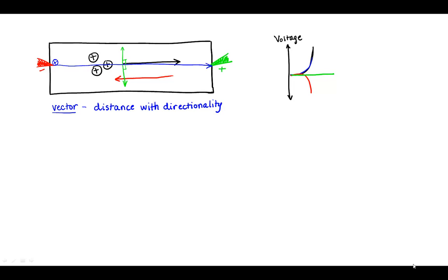Now, applying this concept of using pairs of electrodes to detect moving charges to a patient in order to get an EKG tracing, you might expect that you could put two electrodes on the patient's body and use them to detect how the heart is behaving electrically. And that would be just fine, and it would give you some information, but doctors like to have a lot of information.